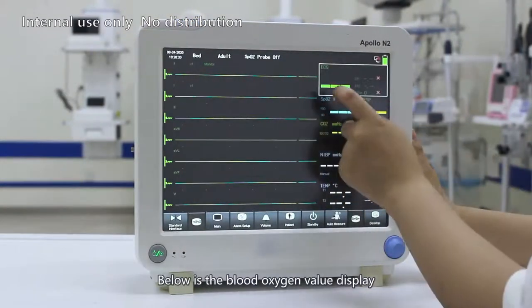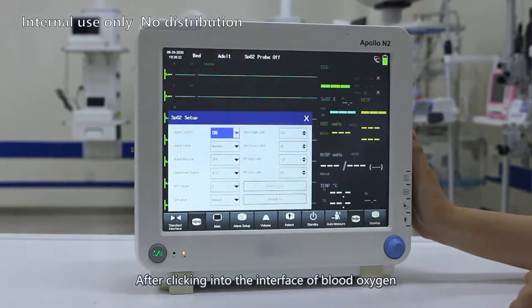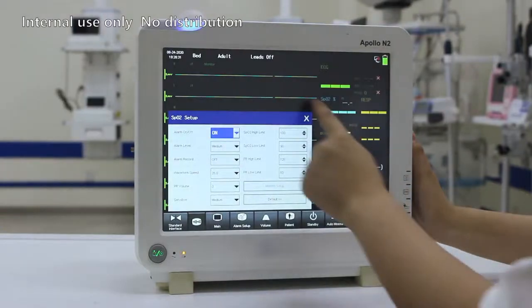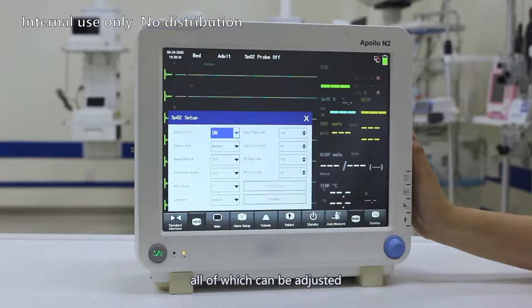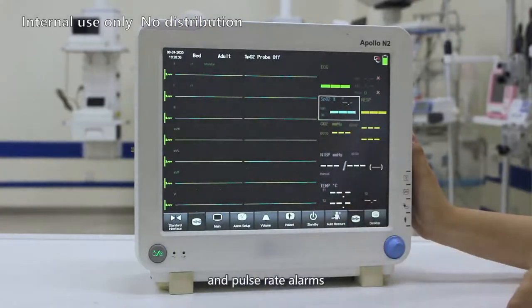Below is the blood oxygen value display. After clicking to enter the blood oxygen setting interface, you can set alarm switch, alarm level, alarm records, waveform speed, pulse volume, and measurement sensitivity below, all of which can be adjusted. On the right are the upper and lower limits of the blood oxygen and the pulse rate alarms.